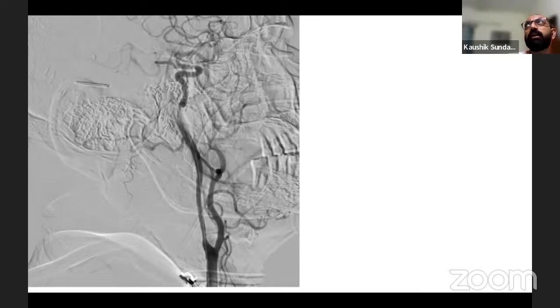When we are looking at an angiogram, you are not looking at angiogram perfection. That is the difference I would suggest between peripheral interventional work and what we do in neuro. As long as the collaterals are good, and to some extent the brain is able to manage, it's okay to see some stenotic lesions. It is okay to see that. Meaning, we don't need to get offended by that, or by it not looking good angiographically. It's not required, because he has been living with this disease for quite some time.